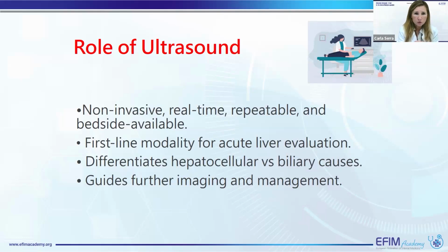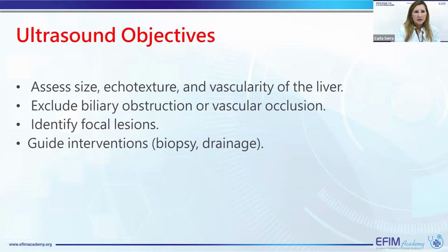And then we can also use ultrasound to guide further imaging management. So this is a really important imaging tool in this context.